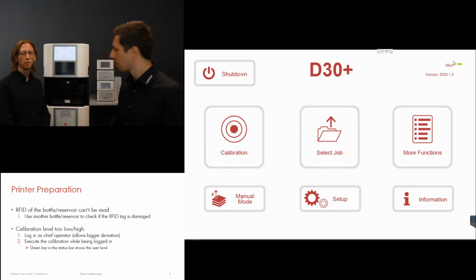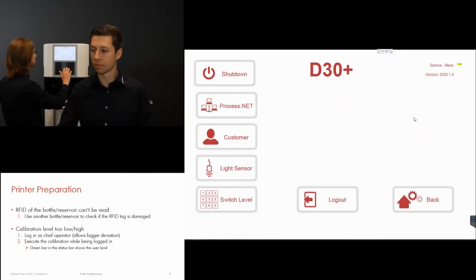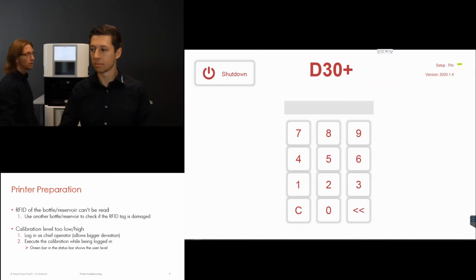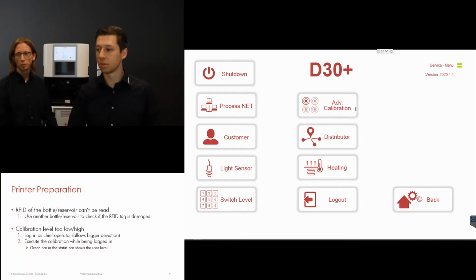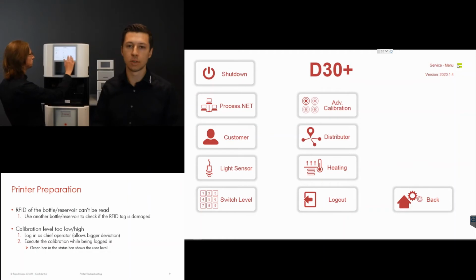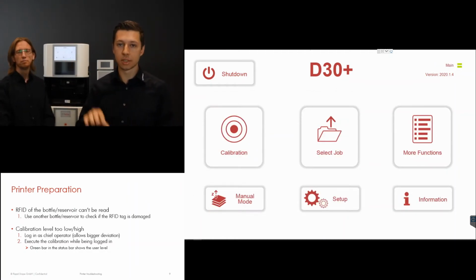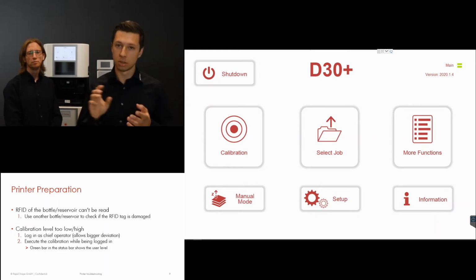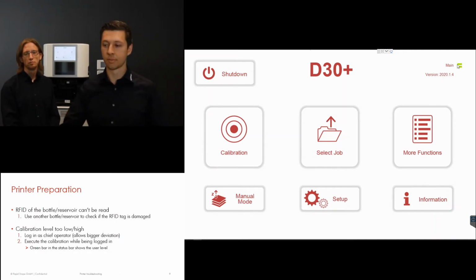All right, let me just go back with setup, just to see the differences between the user levels. Maybe you can just enter. Yes, exactly. So for example, if you go with the distributor password, you can see on the top right two green bars. So you're in the second user level of the printer. And if you go back, it's the same. You can still see top right, I'm still logged in. Now I can do the calibration and it won't show the error message too high or too low.